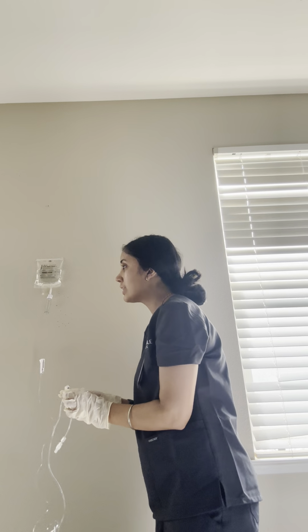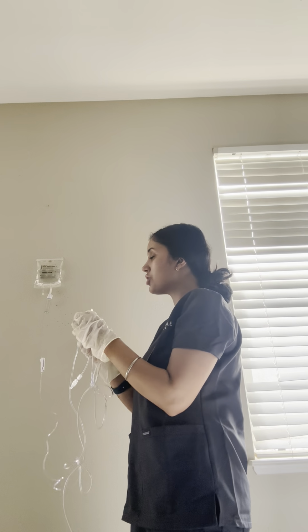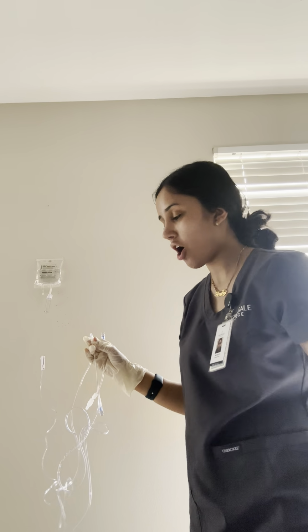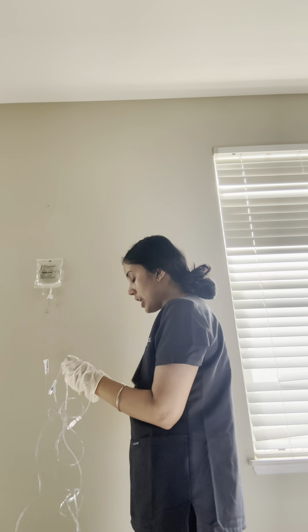And then we will connect this to the secondary piggyback line. So you twist off the clear cap. It comes right off, and then you will connect it and secure it.